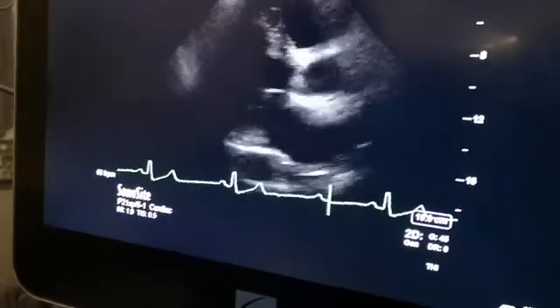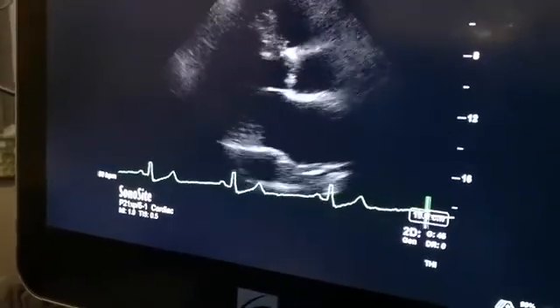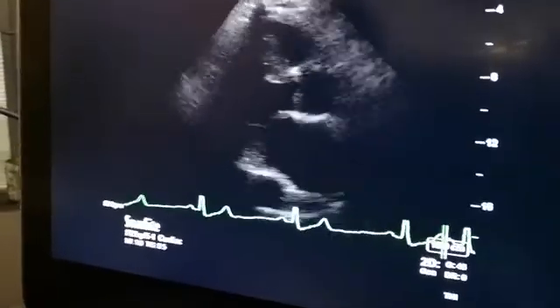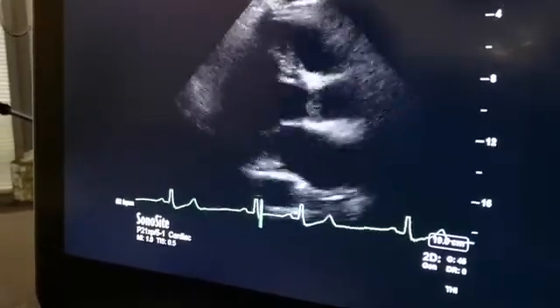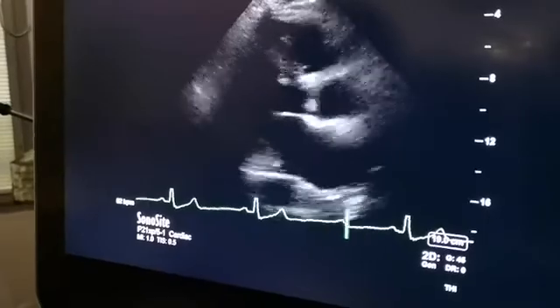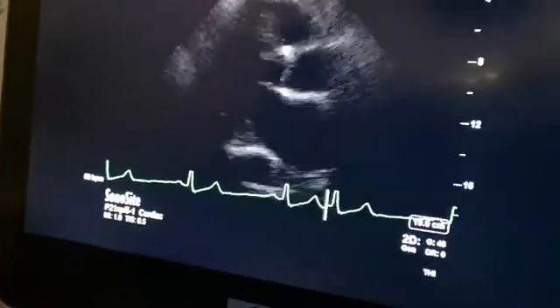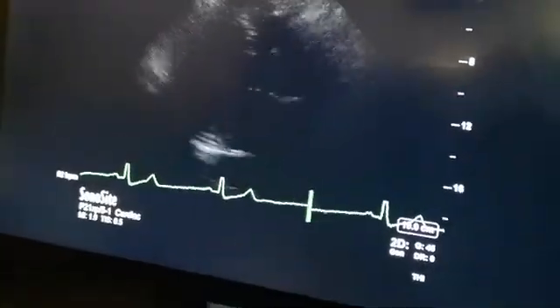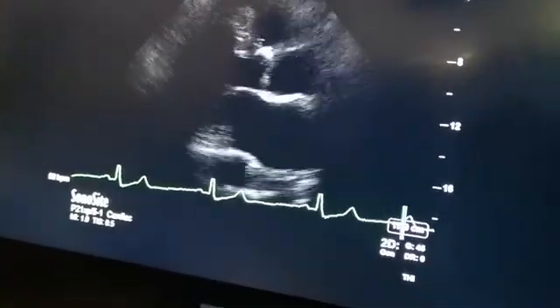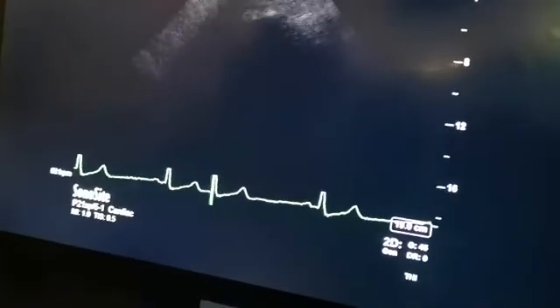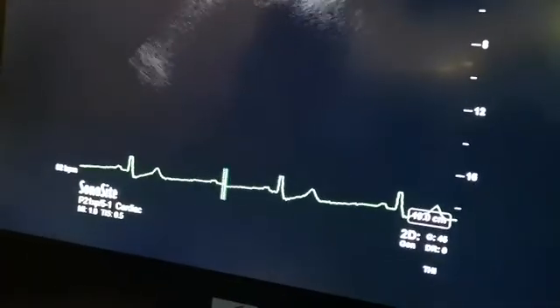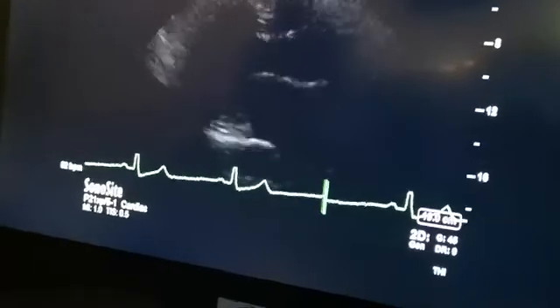If you are not able to see the heart at all, ask yourself: can you see any recognizable structure? Usually that recognizable structure will be the lungs, or ribs and lungs. If you can identify two different structures and work out their anatomical relationship, you can move your probe accordingly. If not, move the probe systematically towards where you think the heart is likely to be until you hit the heart.